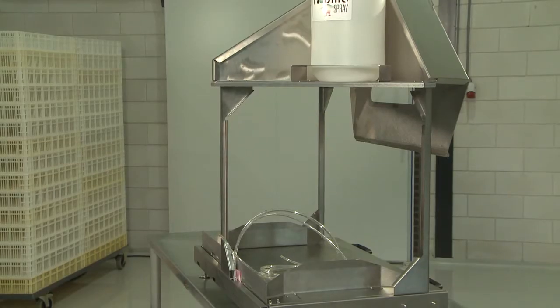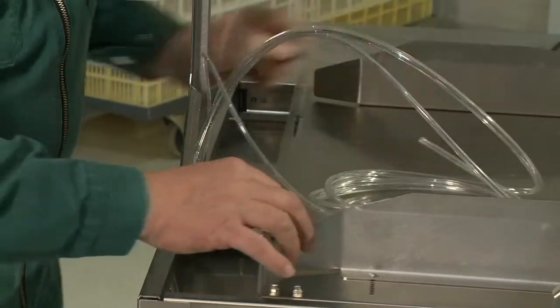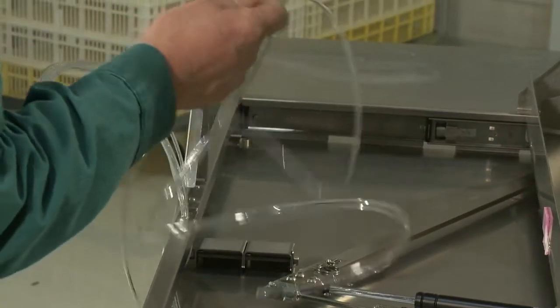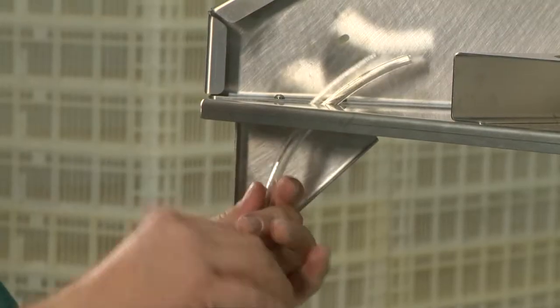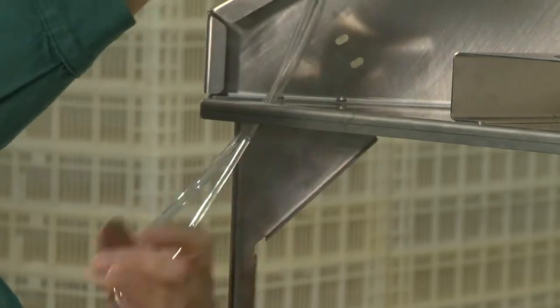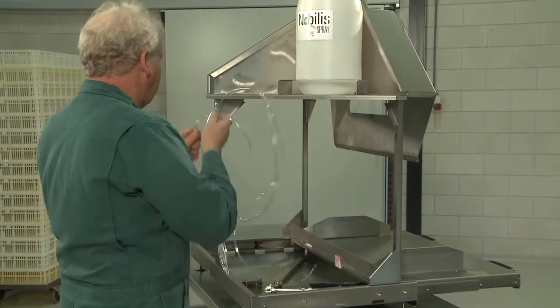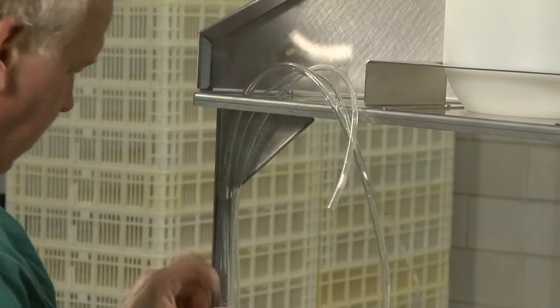All tube connections on the lower part of the Nobilis spray have been pre-assembled from factory side and mounted to the pump cylinder. These tubes are required for agitating and vaccine transportation. Before operating the Nobilis spray, it is essential to connect these tubes with the vaccine reservoir and the spray nozzle. Tubes have 3 different diameters to prevent misconnection and malfunctioning.